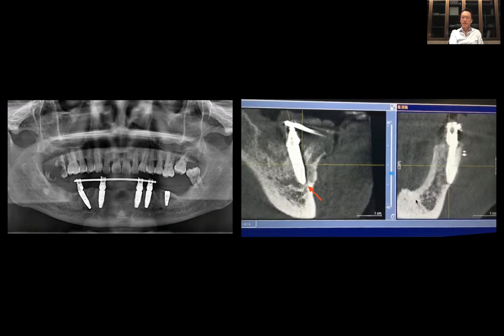Another thing that's quite dangerous is that on the image on the right side, this implant was very, very close to the lingual cortical bone border of this area. Another millimeter off to the lingual, and this implant could have perforated through the lingual cortical plate, which could be a very dangerous situation. So in this type of All-on-4 or All-on-X treatment protocols, I would really recommend everybody to use some type of navigation system. If we try to freehand it, this is what could potentially happen.